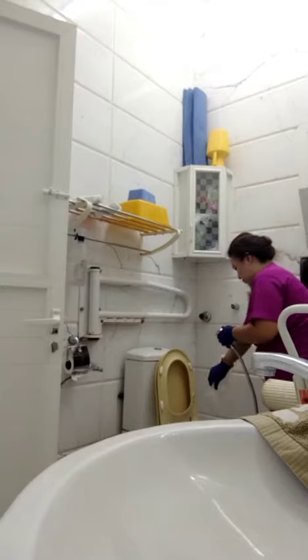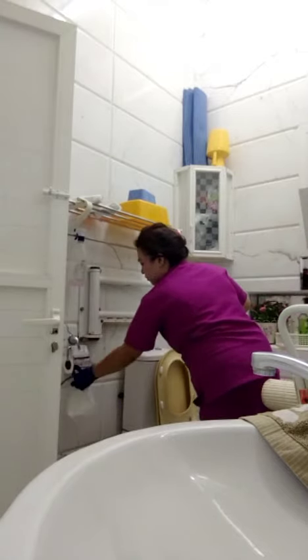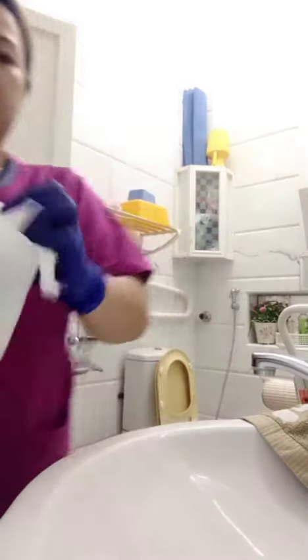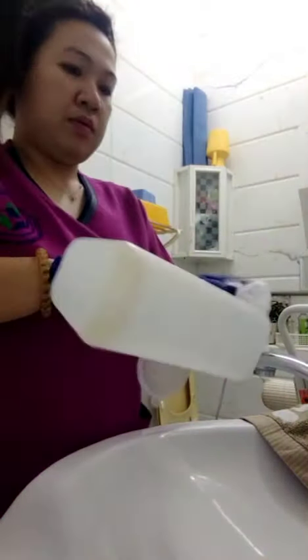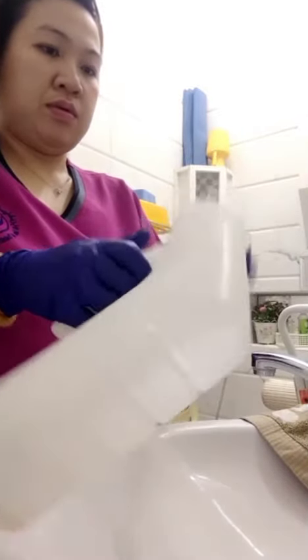Bring the urine to the toilet, then pour it into a bowl. Make sure you have to clean the urinal — clean it thoroughly.